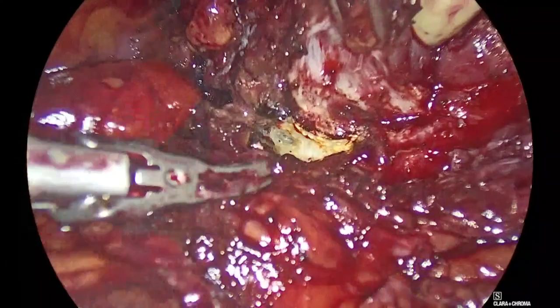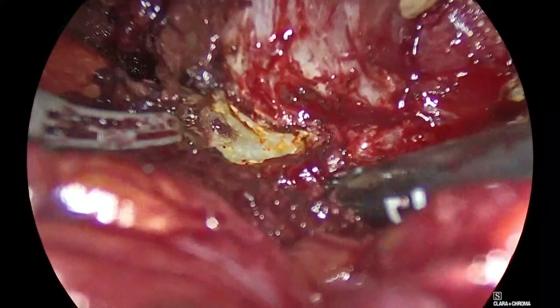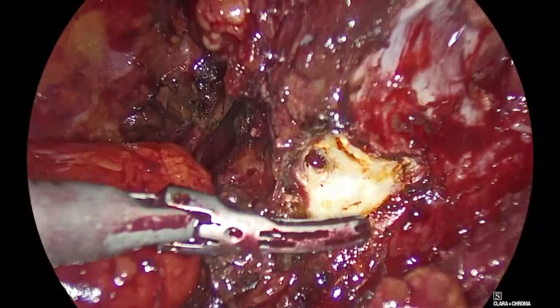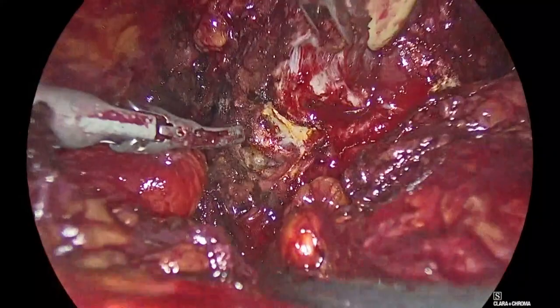Good. Again, bladder. You need to see the bladder all the time. Bladder here. You need to see the extension of the bladder. Come closer, Padeli. Where the bladder comes laterally. You need to pull out the prostate here. Panagiotis, here some. Good. And now, again, you can go deep. Aspirate. Good. Centralize again. Leave it, Panagiotis. Good. Bladder. Padeli, rotate, please.